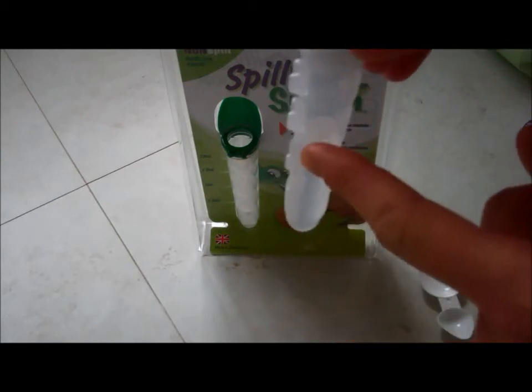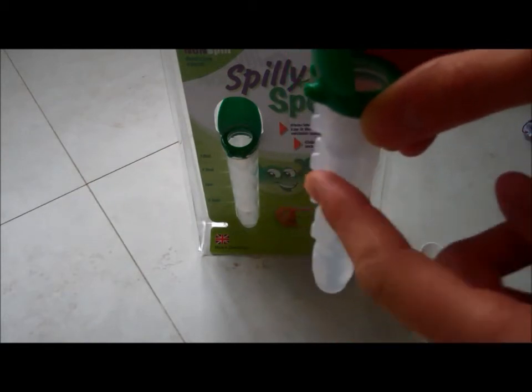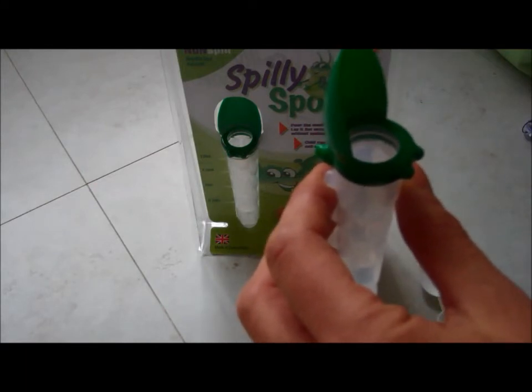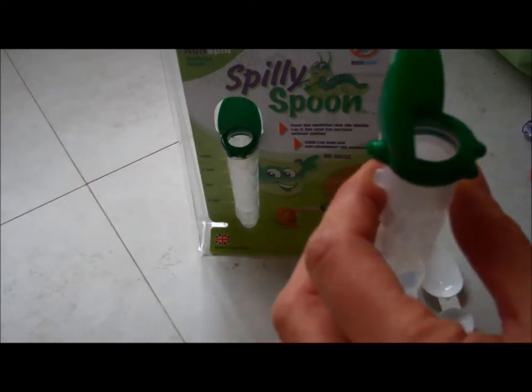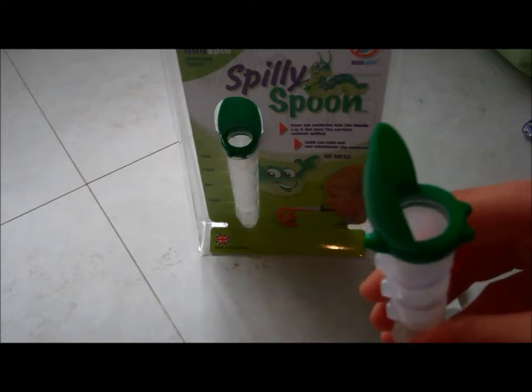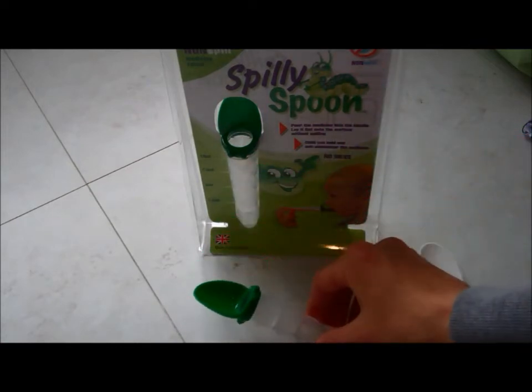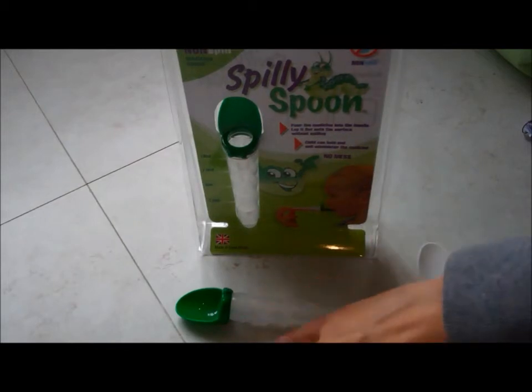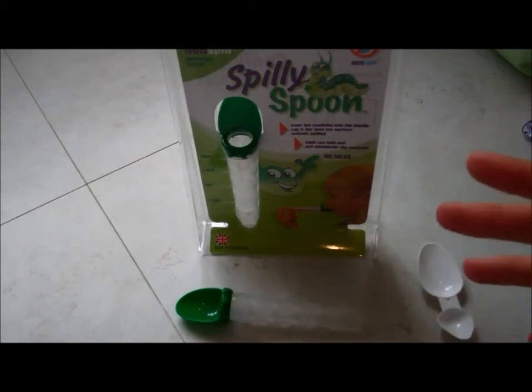So I know if I need 5 mls, it's going to be here; 10 at the top — very simple to do. But once you've filled it, if you need to put the lid back on the medicine, sort the child out, or for any reason you need to lay it back down — even if a baby is having a right fuss and they don't want to take it — you can lay the medicine spoon down and it's not going to spill.